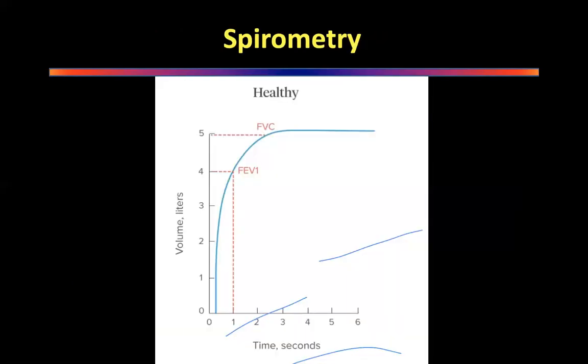So let's start with spirometry. So this is a normal graph of spirometry. I want everybody to start drawing these, please. There is a y-axis which has got 0 to 5, its volume in liters, okay? Actually, it should be 0 to 6. So volume in liters is what you want. And then the x-axis is time in seconds.